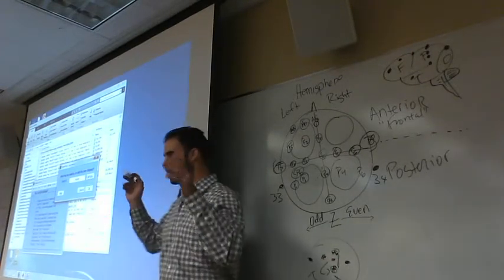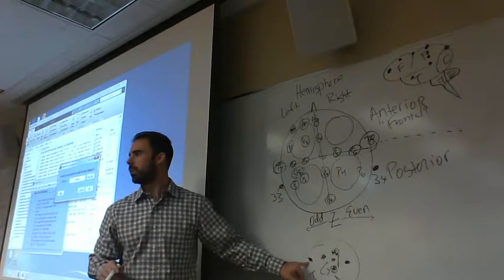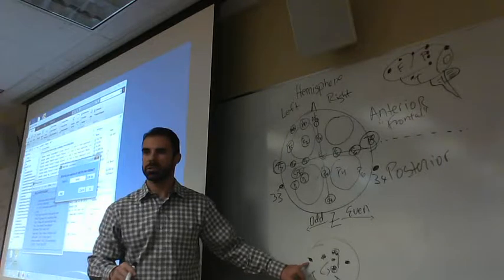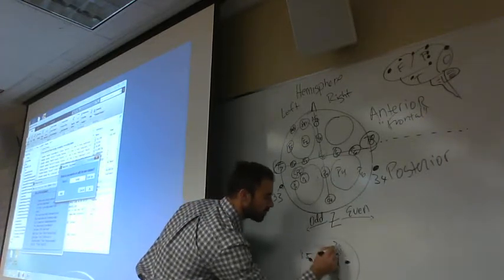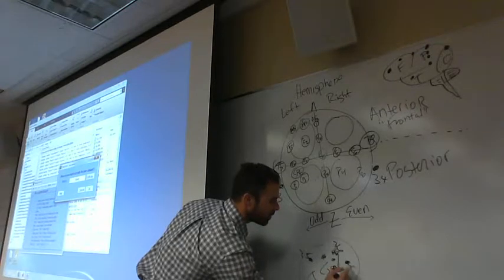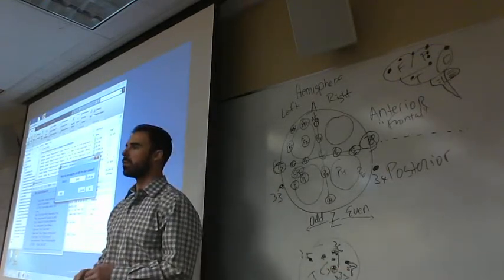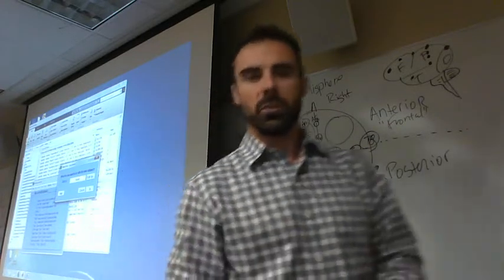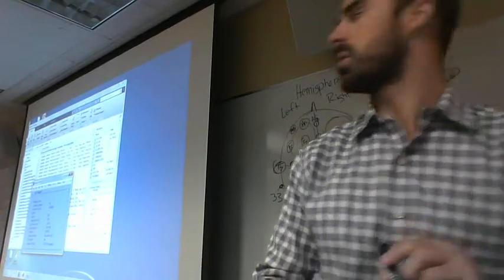Looking at it this way, this is a horizontal electrooculogram, HEOG. So you have 33, 34, and then basically 35, 36, 37, 38, and there's another extra couple channels in there as well that makes our 38 or 40 channels. So when we say re-reference, it saves it, and now we can see that shown here.